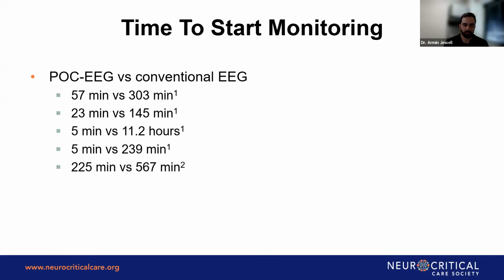So that's an important thing to say, hey, well, if it's 5 minutes versus 239 minutes, for example, and the patient has seizures, theoretically it should make a huge difference in their care if we're able to see seizures. We'll give some numbers on that as well, if that's also an important part.